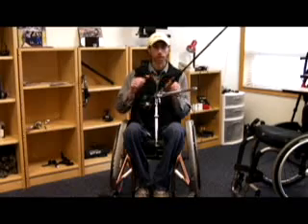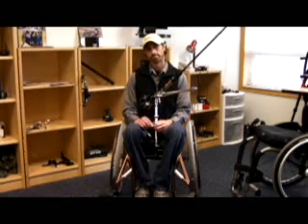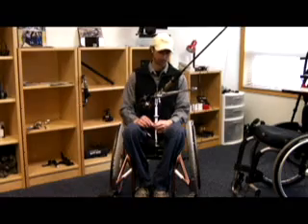Once the rod is adjusted to the user's preference, you are ready to hook the battery up.